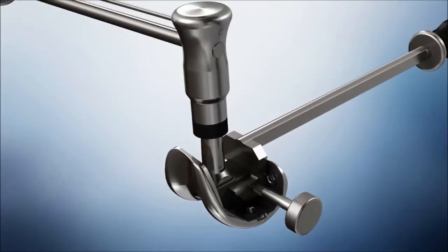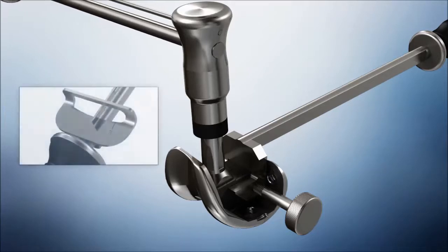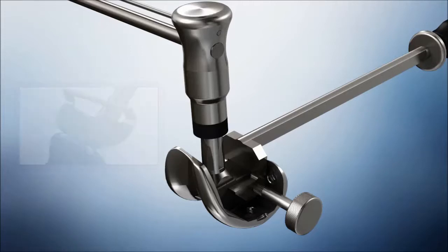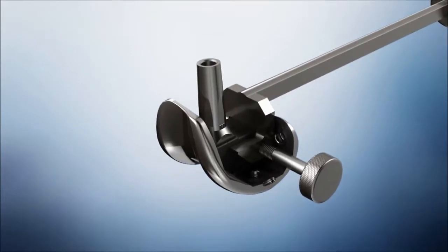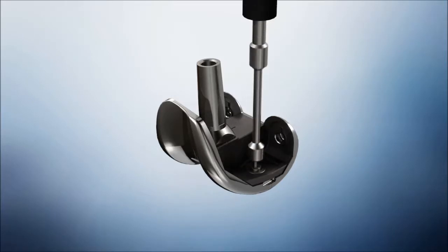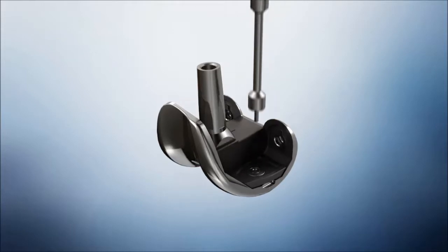Attach the Sigma knee femoral adapter holding clamp to the femoral implant and the Sigma knee femoral adapter torque wrench to the Sigma knee femoral adapter implant and move clockwise to tighten the adapter. The torque wrench deflection beam must reach the appropriate 270 inch-pound mark. Attach the appropriate femoral augments using the wobble bits included in the augment package. Assemble using the augment T-handle provided.